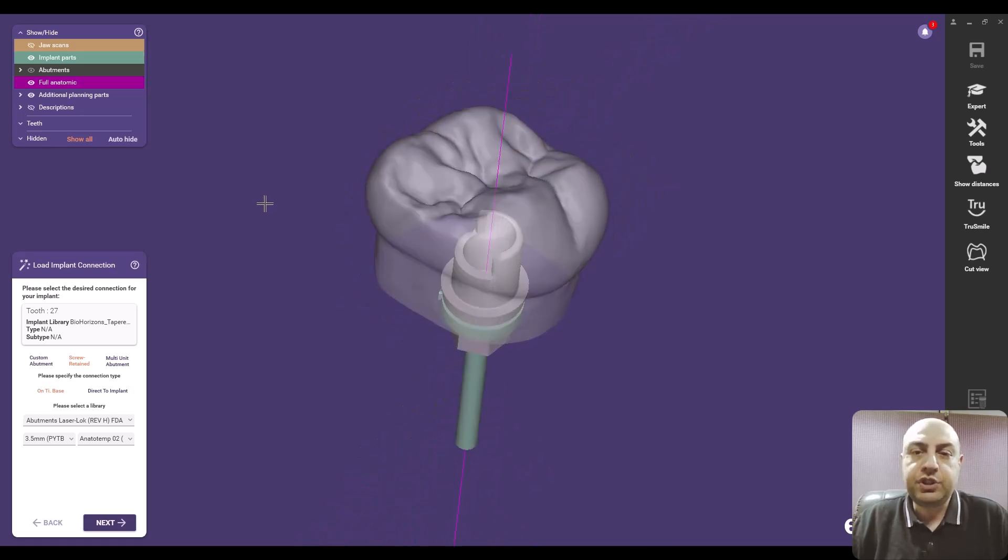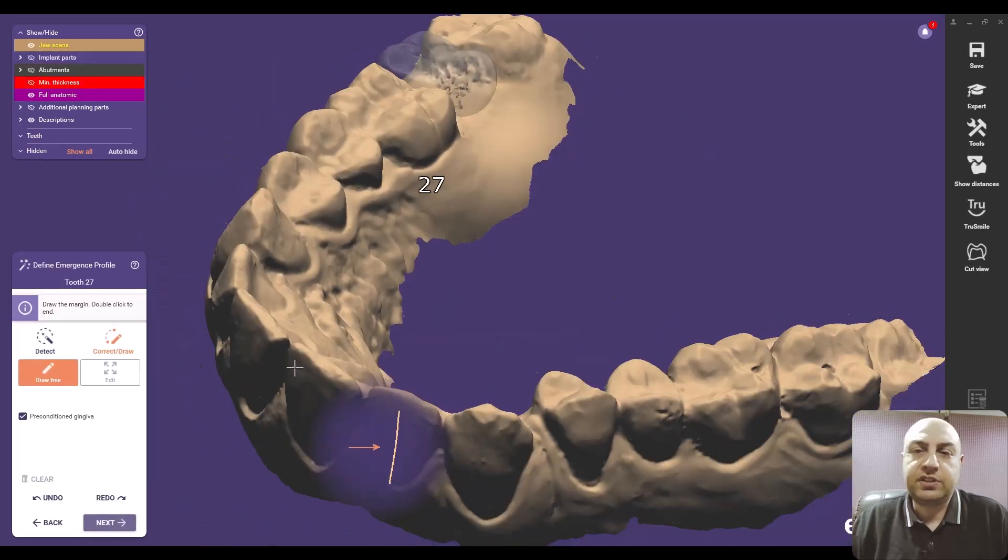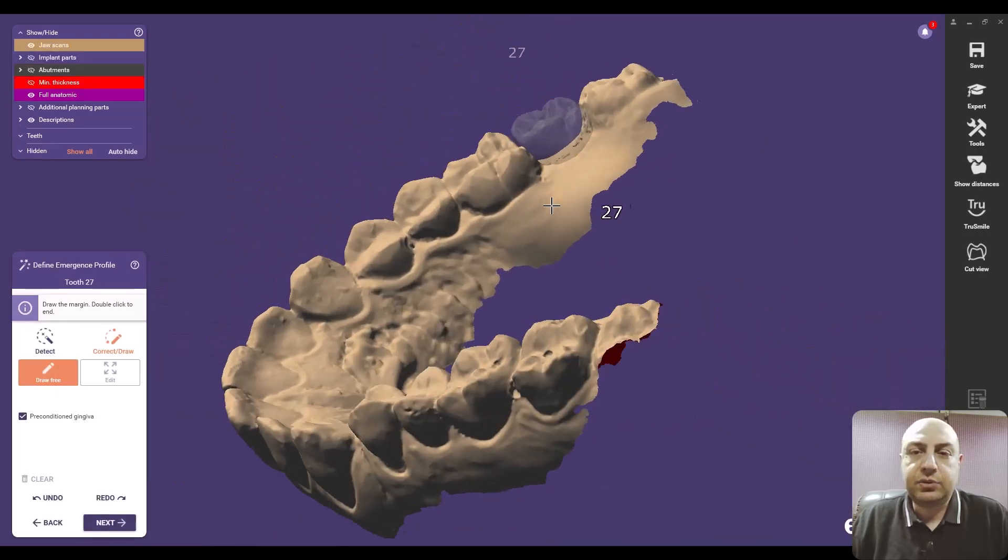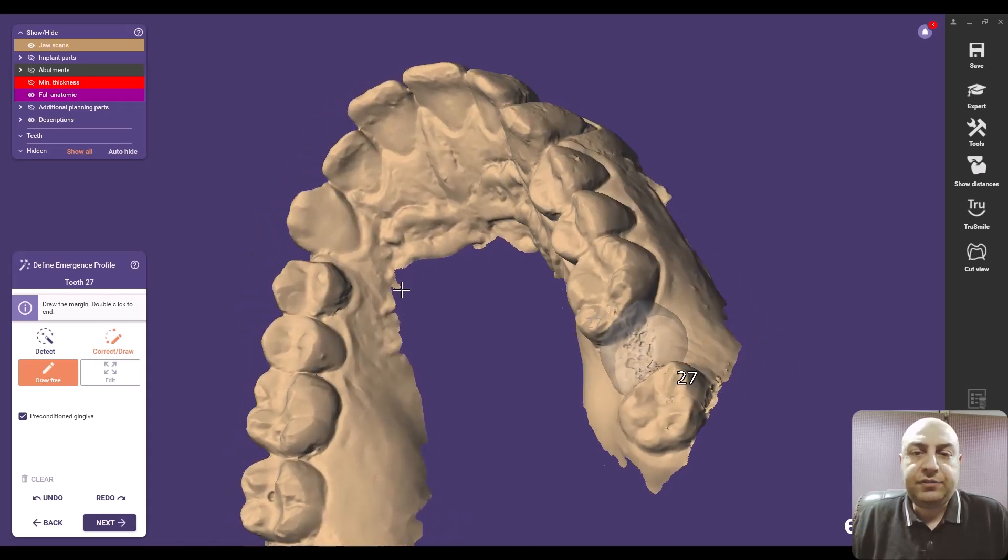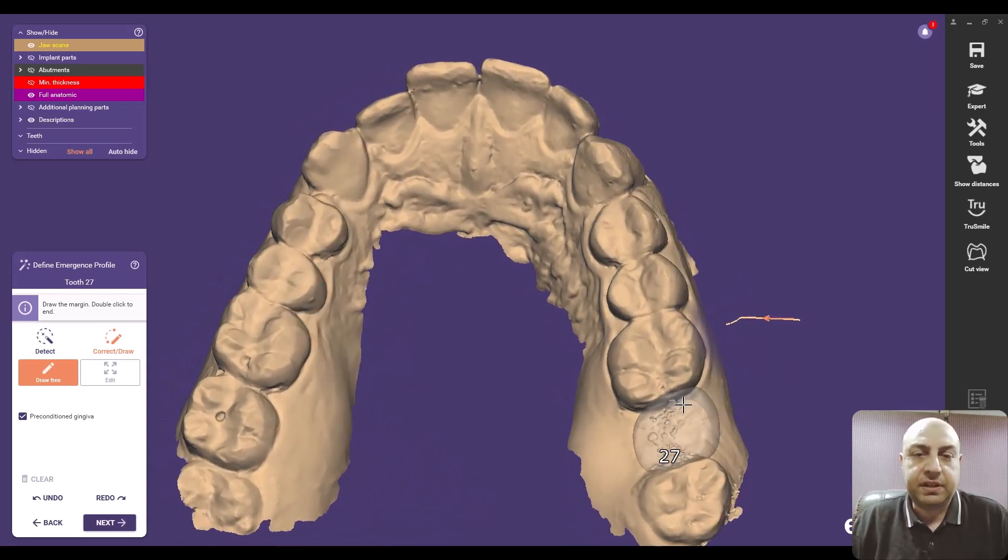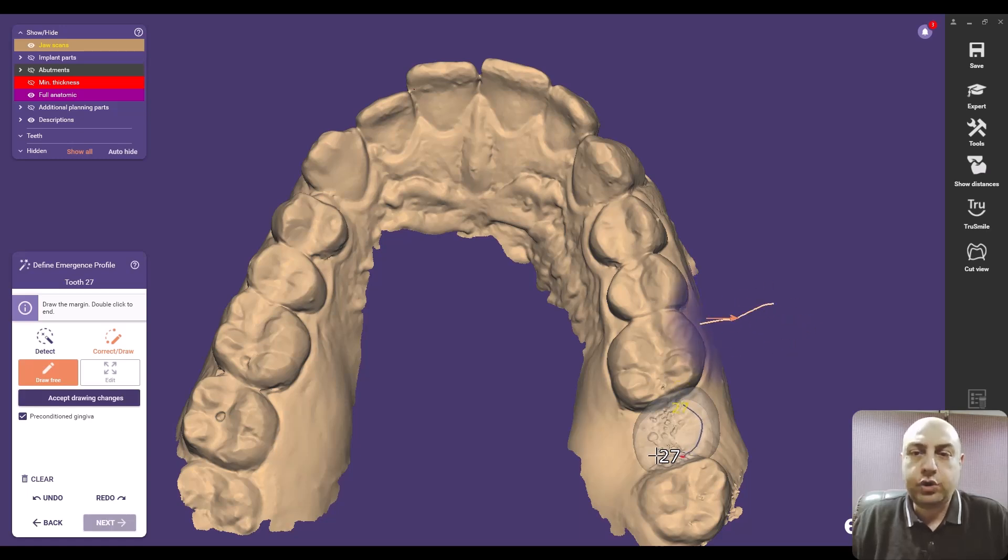And now we can start designing the restoration based on the position of the implant, as you can see. Now we start, we are starting a simple Exocad project as if you have registered the scan body without using a scan body and click next.